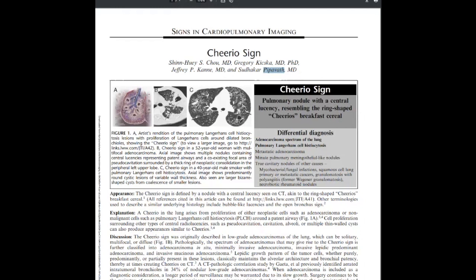The differential diagnosis includes multifocal adenocarcinoma giving you this appearance, as well as pulmonary Langerhans cell histiocytosis (PLCH). In my experience, PLCH is the most likely diagnosis to cause this pattern in diffuse nodular lung disease. However, PLCH is almost always upper lung predominant and gives relative basal sparing — which we are not seeing here. Here we're seeing basal predominance, so I think that more or less excludes PLCH. As radiologists we seldom say never, but in this case I think we can: PLCH should never be basal predominant and should nearly always give some degree of basal sparing, especially in the costophrenic angles.